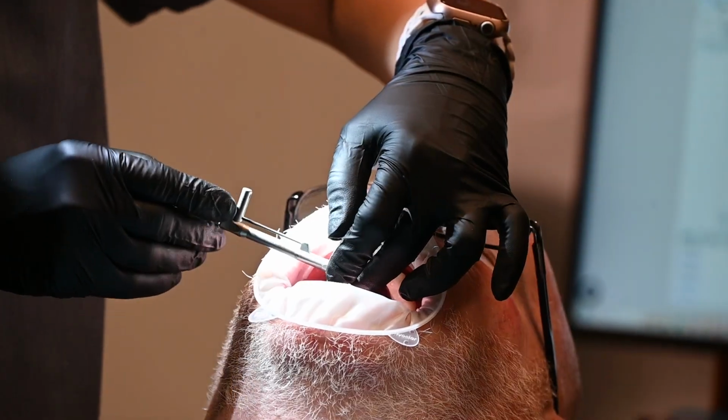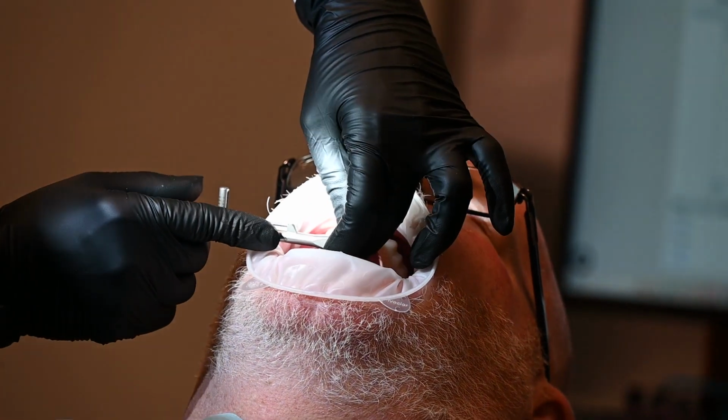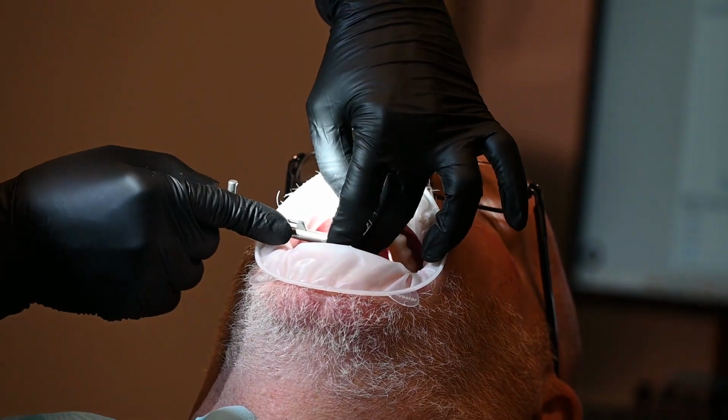We try to put as many implants as we need, right? There are cases where we may need 4, cases where we may need 6, sometimes we need 8, depending on, of course, the length of the implants, and whether we're putting the prosthesis in the same day or the day after. If we're immediately loading the case, then we may need a few more implants, or maybe longer implants. But the surgical part takes between 1 hour and a half to 2 hours and a half, more or less.